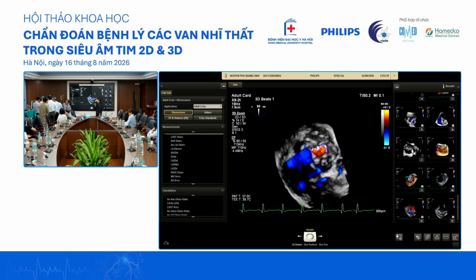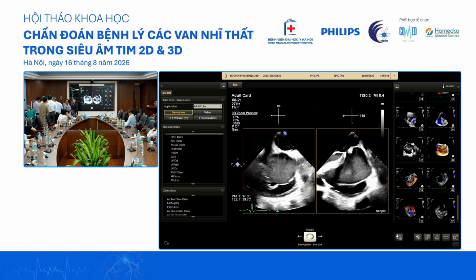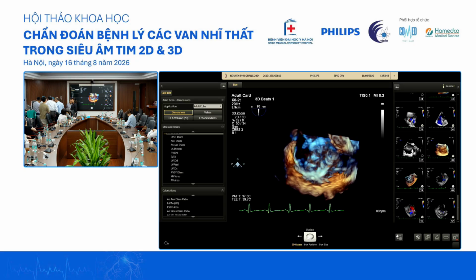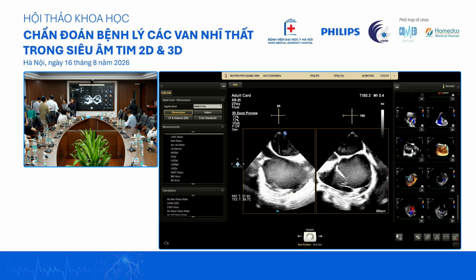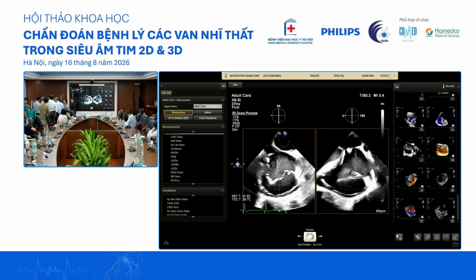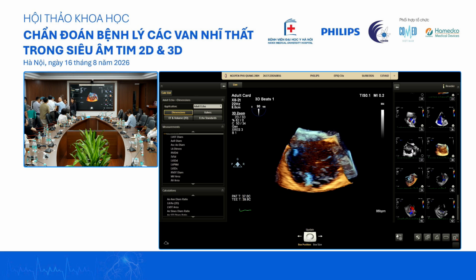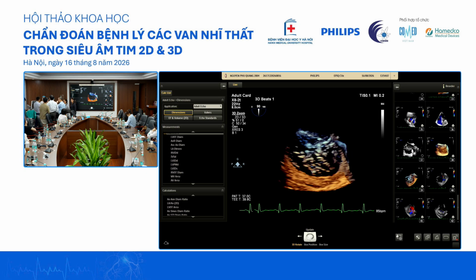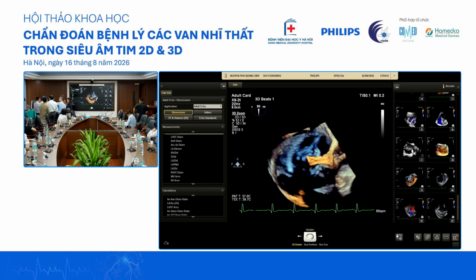So we turn off the color. Look at that. Oh, sorry. No, it's okay. Because you want to make sure there's no primary here. Aorta at 5 o'clock. So you always prefer the septum at 3 o'clock? Septal will definitely be there, always. Sometimes your septum is up, sometimes your septum is down. Might as well just always do that.